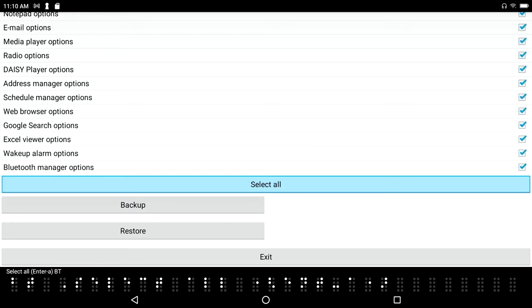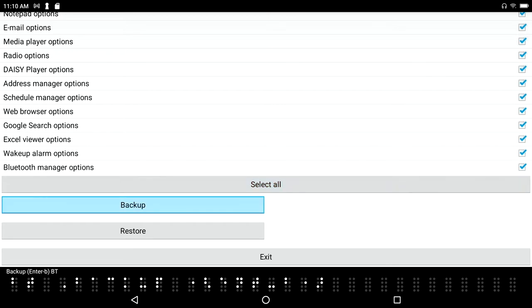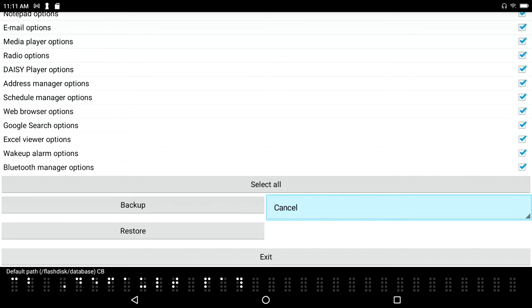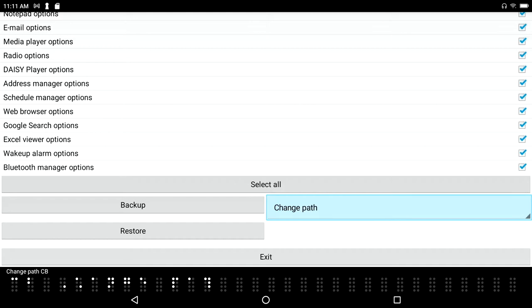But if I tab over: select all. I can simply select all, and if I tab again: backup. So I've selected all those things and let's say I want to backup. Default path: flash disk database. I see flash disk database. I am on my BrailleSense 6 not the Polaris here, so this structure might look a little different to you but the concept is the same. I'm going to press backspace to move up one level. Change path is what I want to do, I'm going to press enter on that.